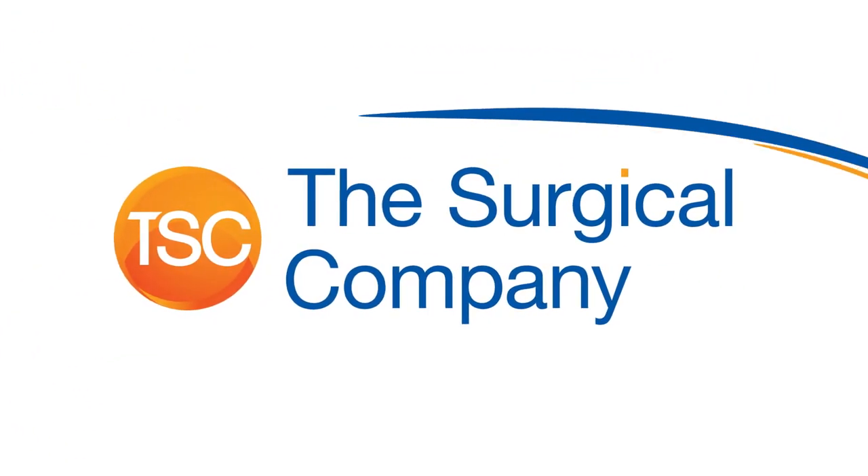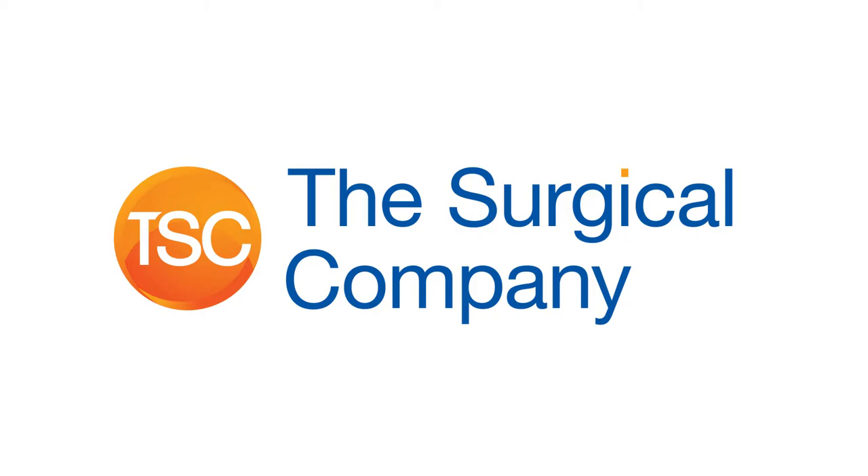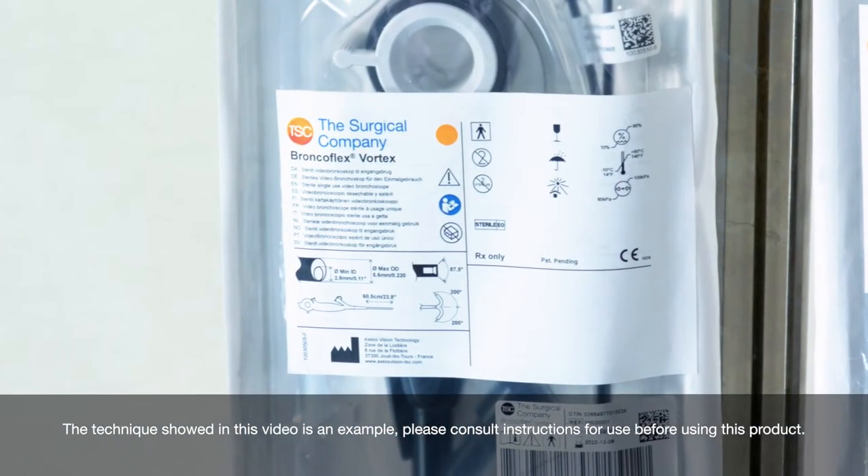The technique shown in this video is an example. Please consult the instructions for use before using this product.